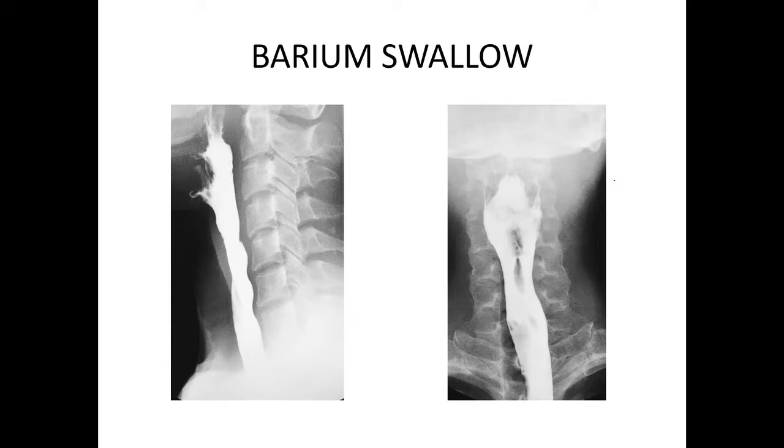Now, when you talk about barium series, it's a contrast study that evaluates the gastrointestinal tract using barium salts. Barium salts or barium sulfate is the contrast. Usually it is a non-water soluble contrast. So because it is not soluble, it is not absorbed to give a systemic toxicity.